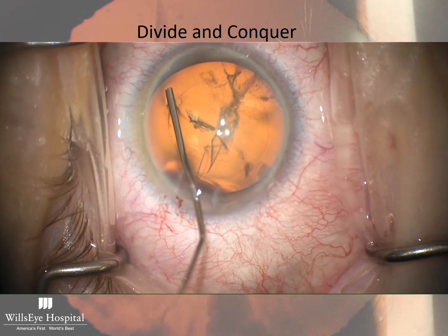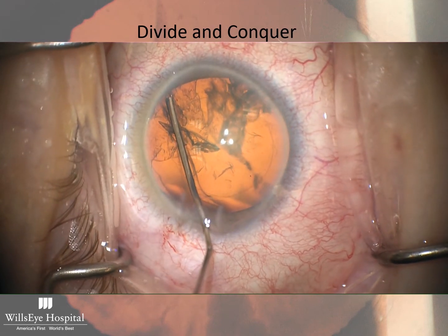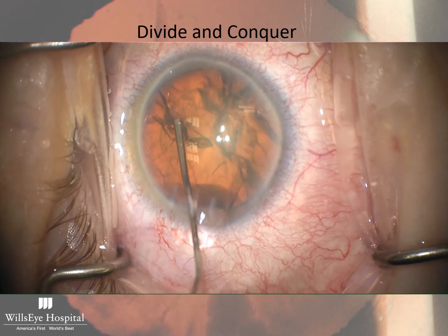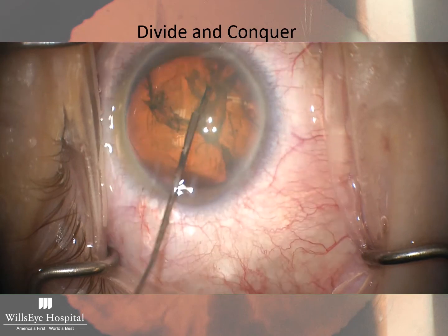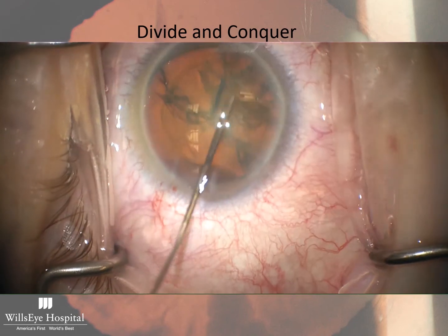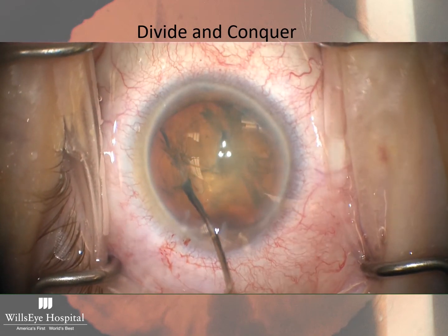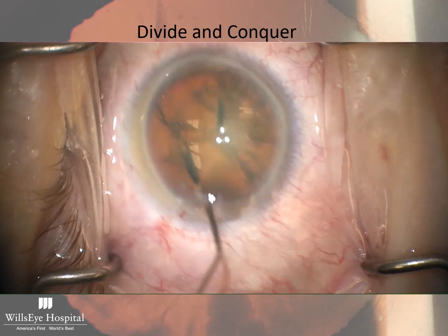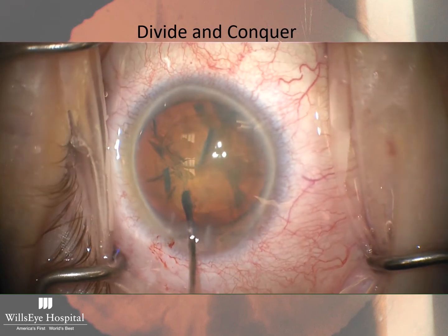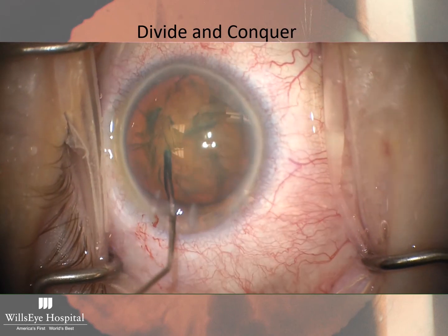Here I'm using a hydrodissection cannula, flat hydrodissection cannula. You can see that the fluid wave is starting. There it goes posteriorly. I push down. I always do a second wave to make sure I have good hydrodissection. That's of utmost importance. Press down, and then you want to rotate. You need to be into the epinuclear endonuclear junction to make sure you develop enough torque to rotate the lens.